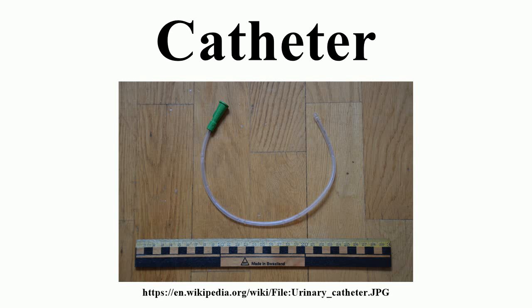Uses. Placement of a catheter into a particular part of the body may allow draining urine from the urinary bladder, as in urinary catheterization, e.g., the intermittent catheters or Foley catheter, or even when the urethra is damaged, as in suprapubic catheterization. Drainage of urine from the kidney by percutaneous nephrostomy. Drainage of fluid collections, e.g., an abdominal abscess. Administration of intravenous fluids, medication or parenteral nutrition with a peripheral venous catheter.